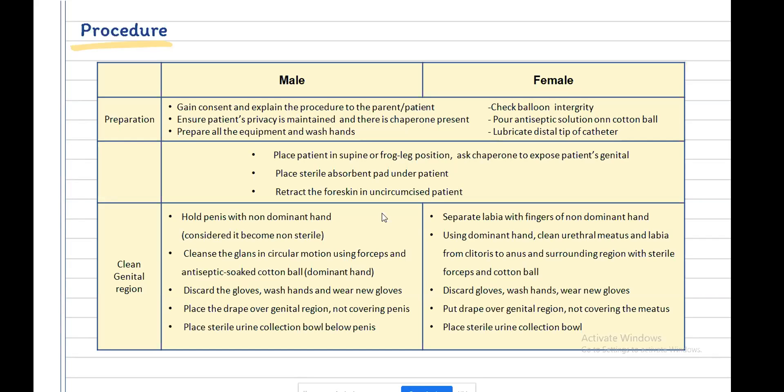Place the drape over the genital region without covering the penis and place a sterile urine collection bowl below the penis. To clean the genital region in females, separate the labia with the non-dominant hand while using the dominant hand to clean the urethral meatus and labia, directed from the clitoris toward the anus and surrounding region, using sterile forceps and cotton balls.